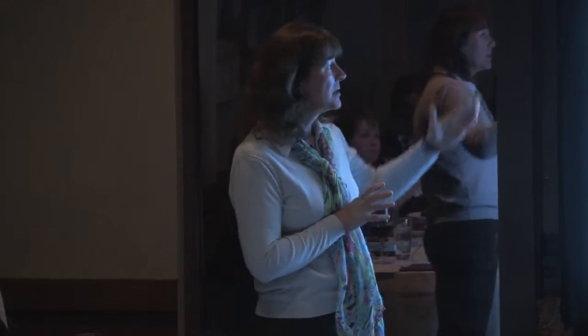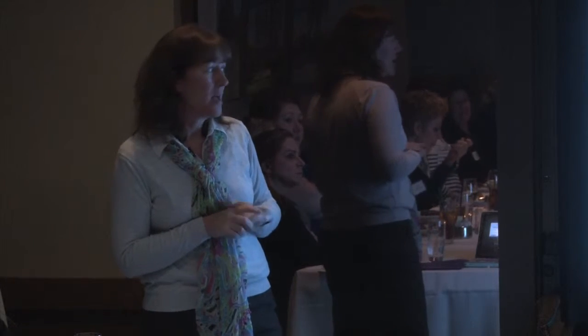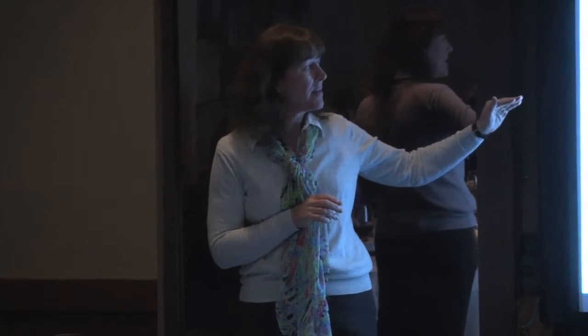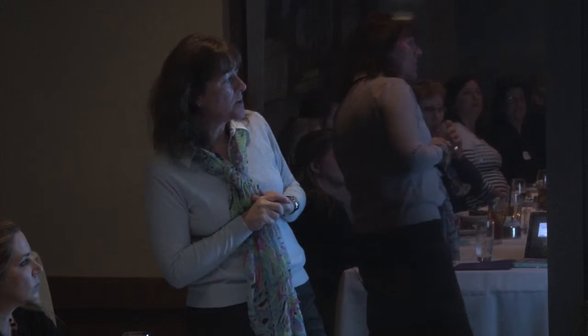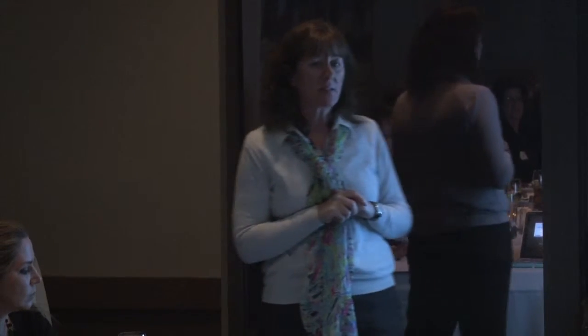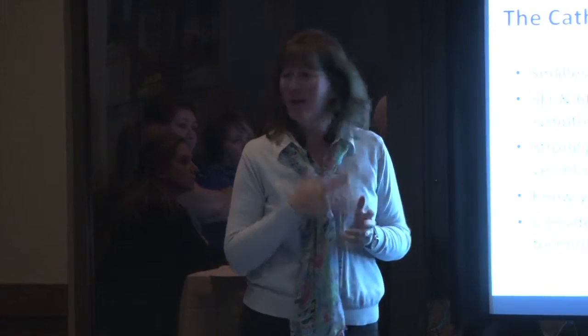The catheter does matter, guys. Smallest device in the largest vein possible. 5 French and 6 French catheters have been identified as risk factors for symptomatic DVT. Strong predictor of thrombosis is catheter to vessel size ratio. And I'm curious, do you guys measure vessel size? Thank you. You guys do my heart good.